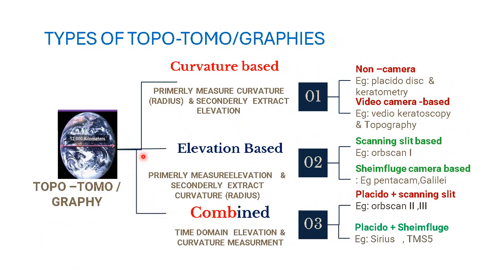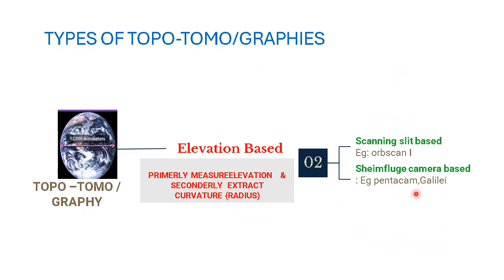After finishing speaking about the curvature-based topography, now the time is for the elevation-based topography. We will speak a few words about the elevation-based topography, especially the scanning slit and the Scheimpflug-based camera, and we will show the difference between these two systems.